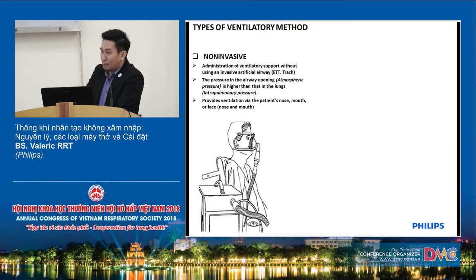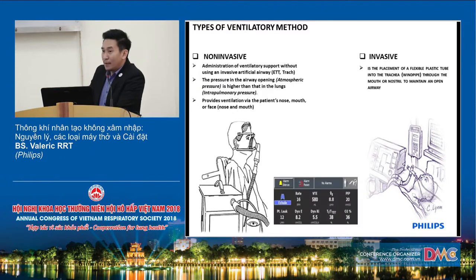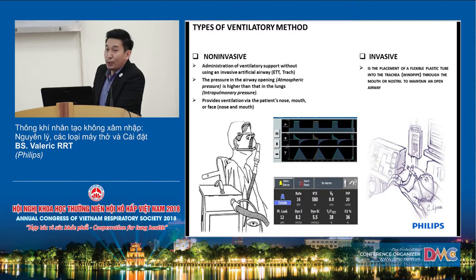So this one is non-invasive. And we have invasive. Invasive is basically the use of an endotracheal tube or tracheostomy for the long-term patient. So both of them, nowadays, most of the ventilators in the market use different types of monitoring for you to be able to know if the patient is responding well to the ventilator or not. So we have different settings, different monitoring for the patient, for the ventilator, like Dr. Soon discussed to us earlier.